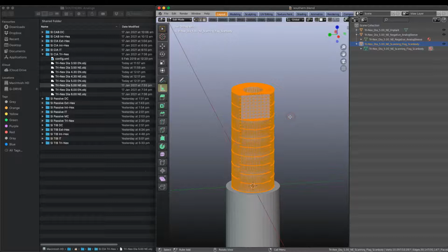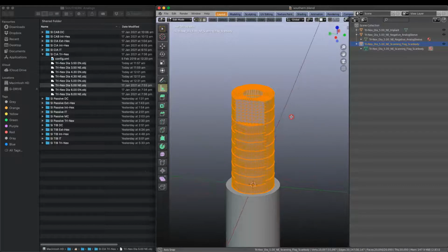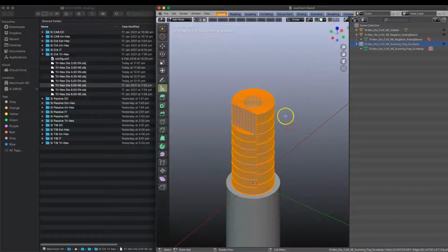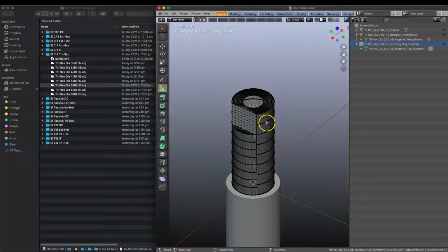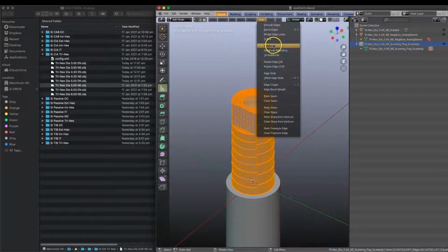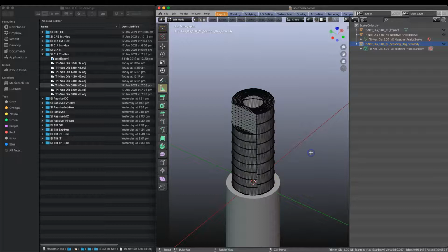Now this is incorrect because the ICP alignment tool, which matches the component ScanBody to the intraoral ScanBody, will seek out vertices and match vertices of this part onto vertices of the ScanBody in the intraoral scan. So if you have very little vertices or no vertices and just a face, the ICP will not make an accurate match. So in the instance, if you had too little vertices, you'd go into your edit mode there, you would select all of those, then you go into here, edge, and then you'd subdivide. I'm not going to press that because we've got sufficient vertices there.